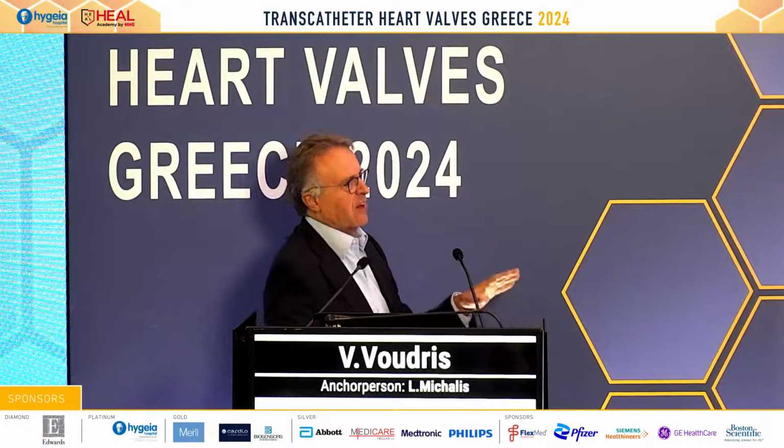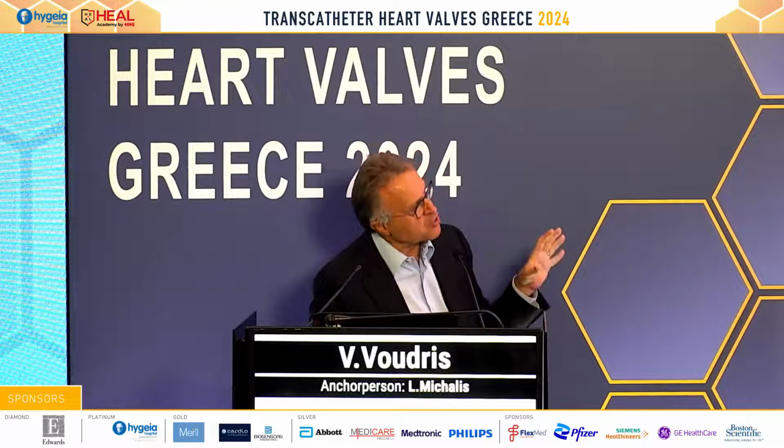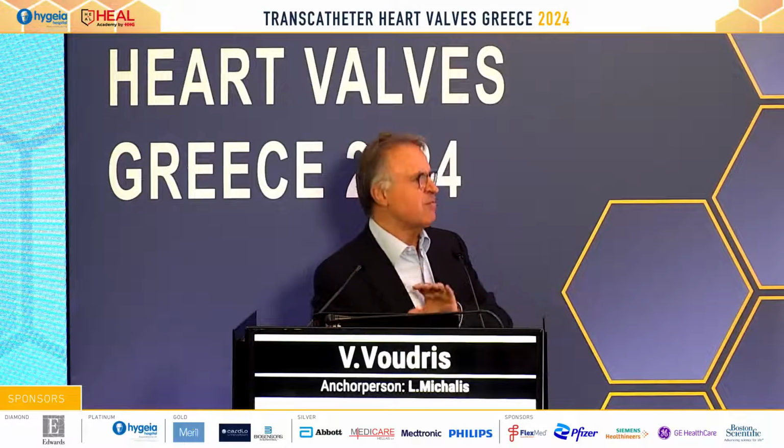I agree with you. I'm not sure if the last category is true bicuspid valve morphology. And we have many cases, yes, many cases with calcifications between two raphes, so you consider it a functionally bicuspid valve morphology.